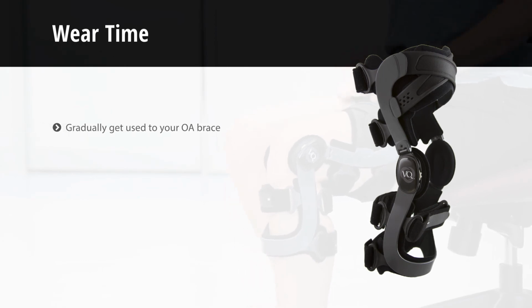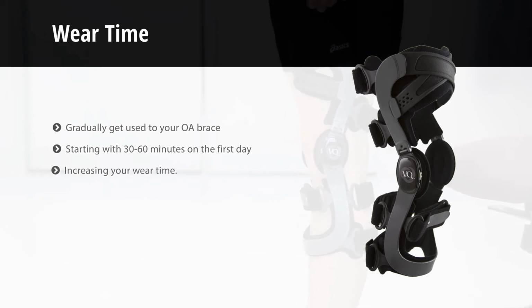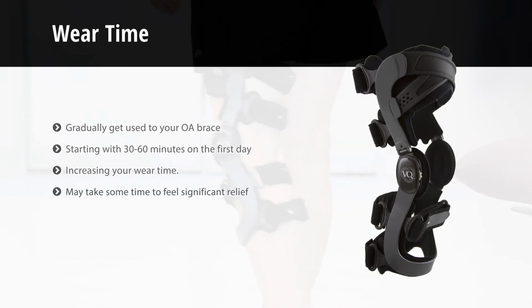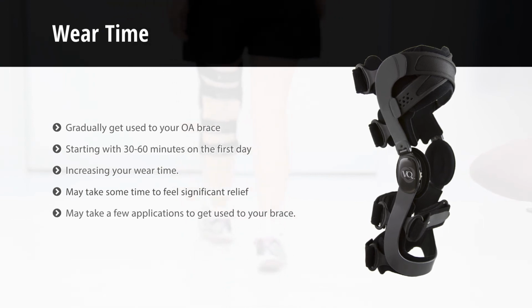Gradually get used to your OA brace, starting with only 30 to 60 minutes on the first day and increasing your wear time. Pain from osteoarthritis may take time to subside, and it may take a few applications to get used to your brace.